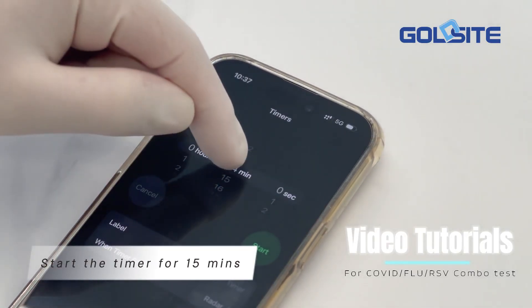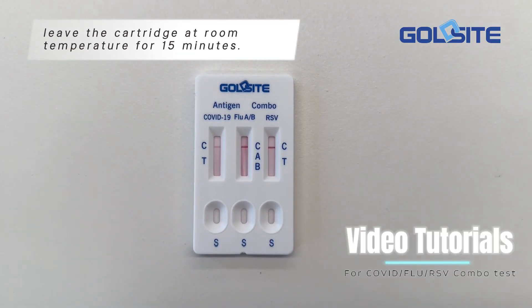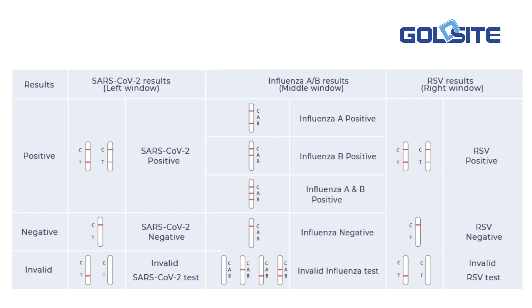Start the timer for 15 minutes. Leave the cartridge at room temperature for 15 minutes. After the 15 minutes, read the results according to the interpretation of results.